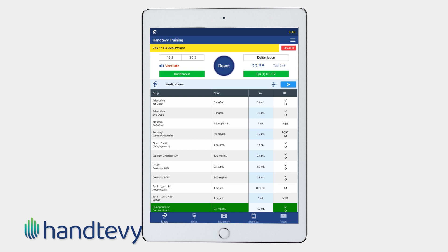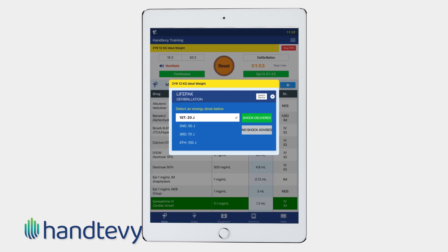At 1 minute and 45 seconds, listen for the charge monitor cue and click on defibrillation. The dose will be pre-selected for you. Keep this window open until the two-minute mark when you hear, "Check rhythm."